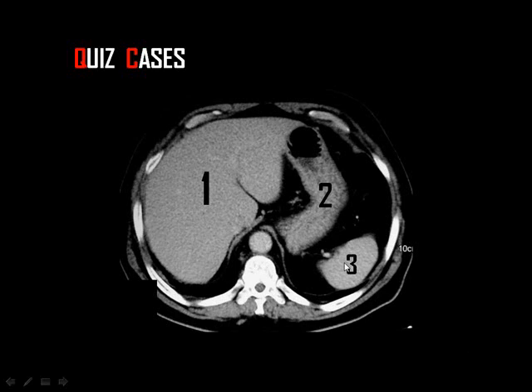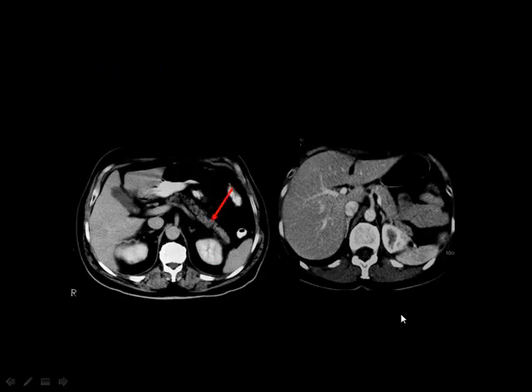Okay, then what is that? The spleen, and this is the diaphragmatic crus, and this is the aorta, and here, yes, this is the tail of the pancreas, and here, gallbladder. If you say bladder, it goes to the urinary bladder. You should specify if there are two kidneys, you should specify that this is the left.